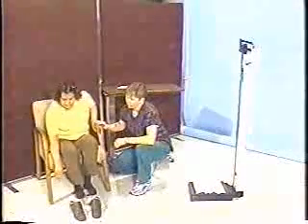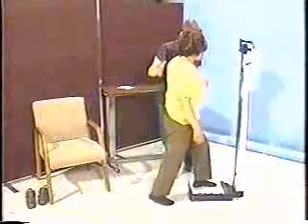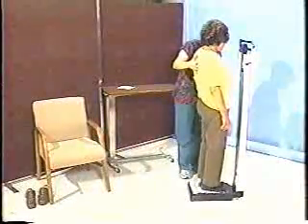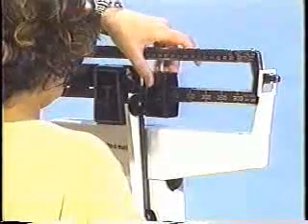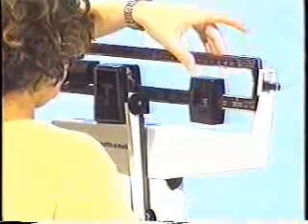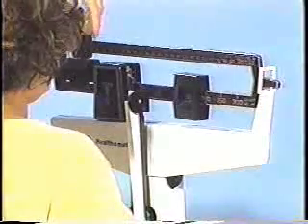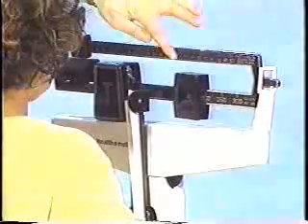Assist the patient onto the scale with the same amount of clothing as the previous weight. Have the patient's arms at their side. The patient should not hold the bar or other part of the scale. Adjust the weight until the scale is in balance. Move the larger weight until the pointer drops to the bottom of the square. Then move the larger weight backward 1 notch. Move the smaller weight until the pointer balances in the middle of the square. Add the larger and smaller weight measurements together. Make a mental note of the weight.